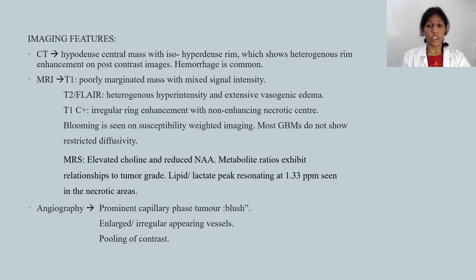However, most GBMs do not show restricted diffusivity. On MRS, an elevated choline and reduced NAA is seen. Metabolite ratios exhibit relationship to the tumor grade. A lipid lactate peak resonating at 1.33 parts per million is seen in the necrotic areas. Angiography, prominent capillary phase tumor blush, and large irregular appearing vessels and pooling of contrast are the features.